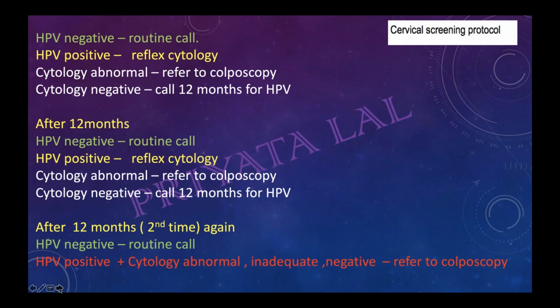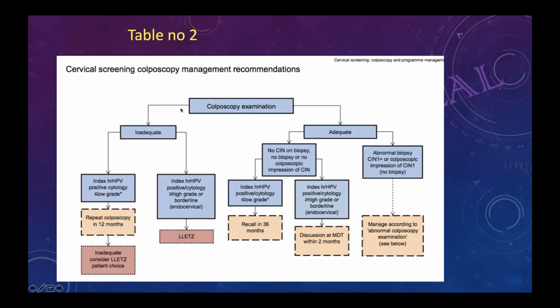Yes, ma'am, please proceed. Okay, now this is table number 2. Table number 2 is colposcopy examination.